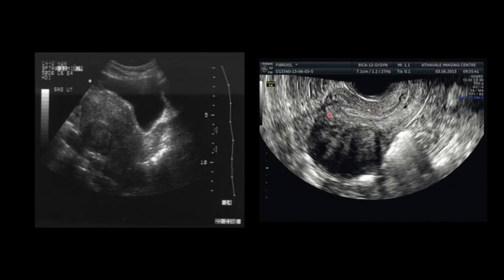And then here we've got an intracavitary or transvaginal probe. Here we're seeing the uterus, its normal contours are around here. Here's our endometrial stripe. And then we have this really large circular mass coming from the surface or external surface or serosal surface of our uterus, which represents a subserosal fibroid.